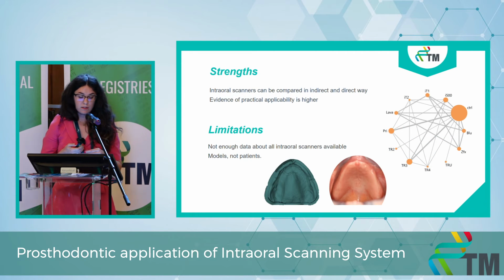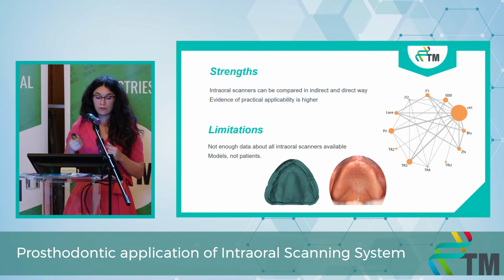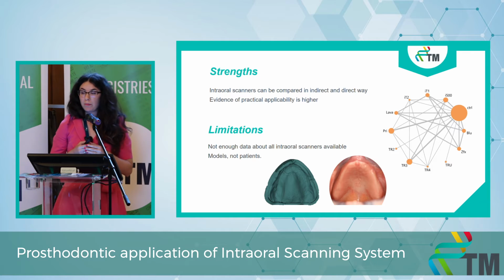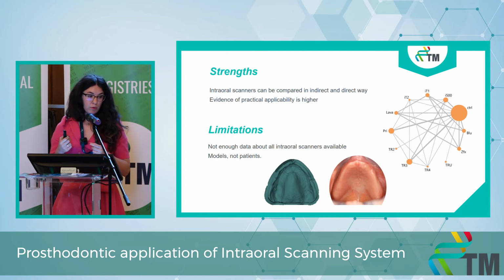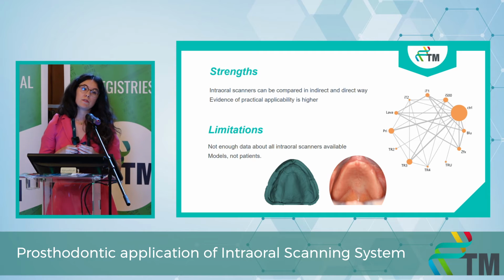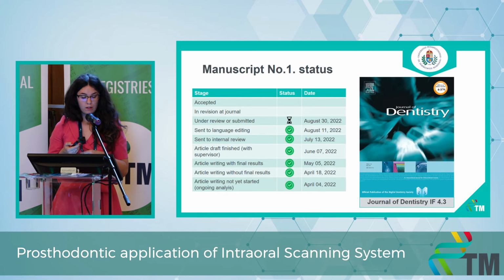As for strengths, intraoral scanners can be compared indirectly and directly in this network meta-analysis. Therefore, the evidence of the practical applicability is higher in this case. And in the limitations, I have to say that we don't have enough data about all the intraoral scanners available in the market. And also, mostly they use models and not patients. Therefore, these kind of results are rather indirect than direct ones. Now I am in the phase of the submission.